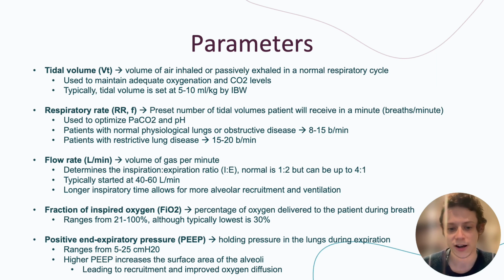And last is the positive end expiratory pressure, also called PEEP. This is the holding pressure in the lungs during expiration. You can think of it as the lowest pressure achieved during mechanical ventilation. It can be thought of like when you blow up a balloon and let out some of the air, but you don't let out all of the air. The pressure inside that balloon is the PEEP at its lowest.